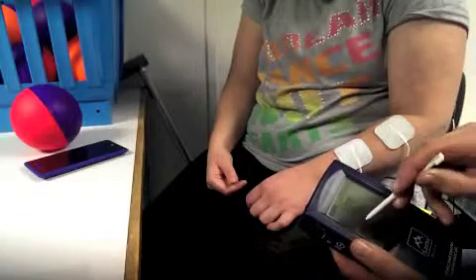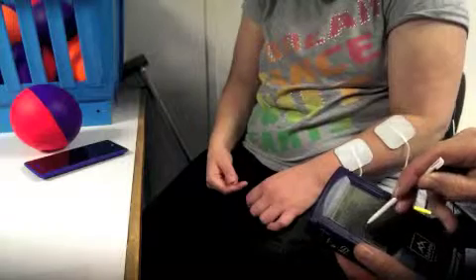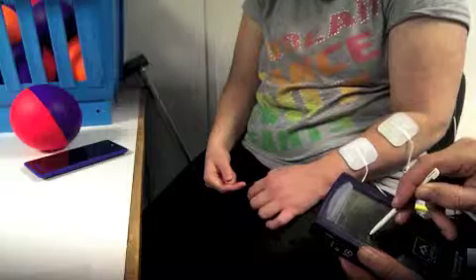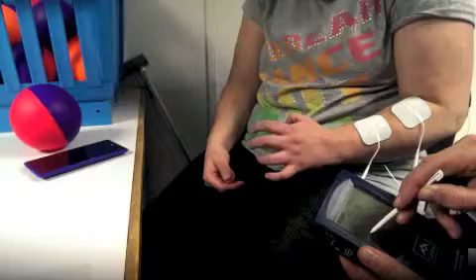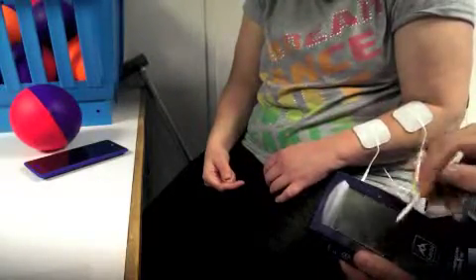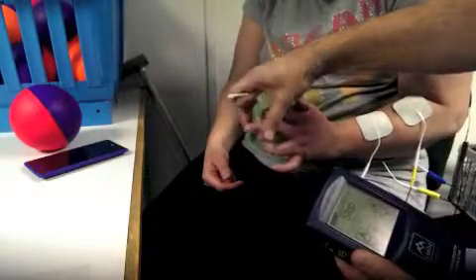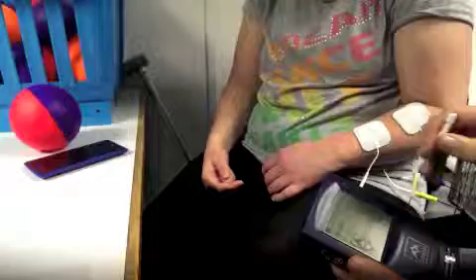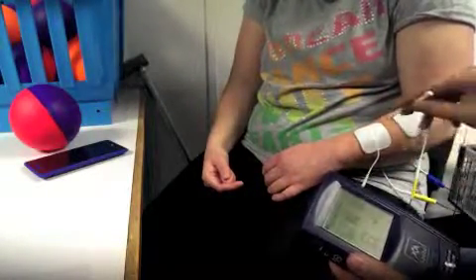We tell our individual that they're going to get a small tingling — tell me when you can feel the tingling. Patient: It's starting to tingle now. Can you see your fingers opening up? Is that OK, painful or not? Patient: Yeah, that's fine. So that was 21 milliamps, running on the cycle. There we have our opening — we've got soft tissue shortening, and that's why we don't get a full opening, but we have extension. And stop.